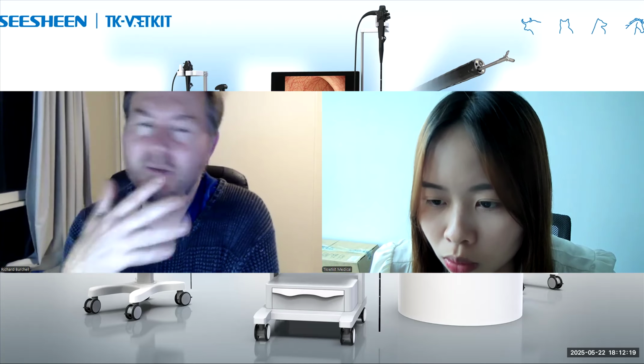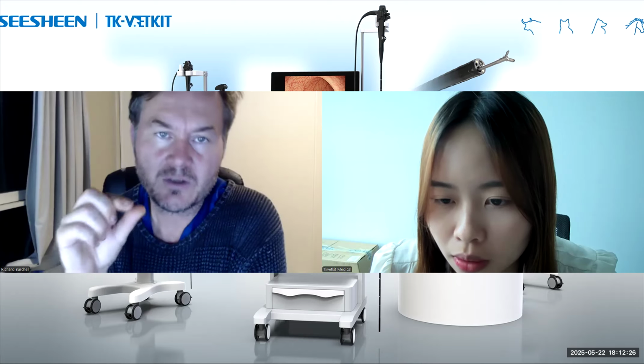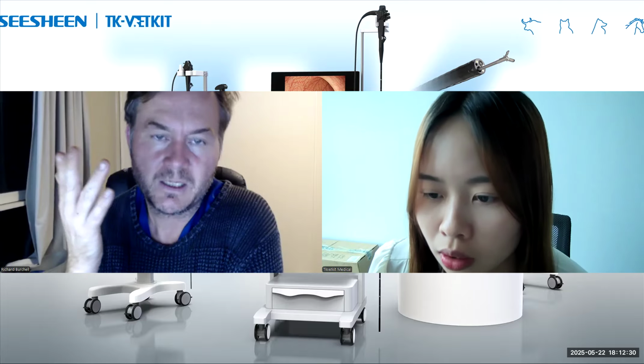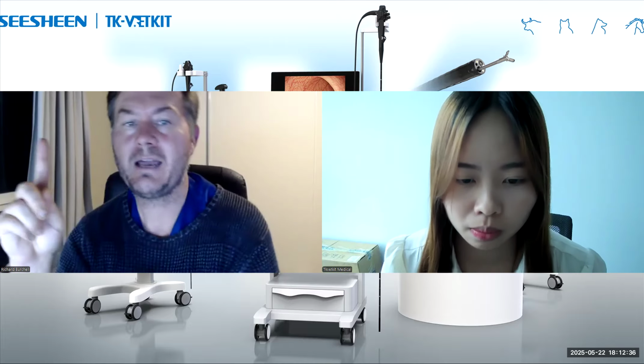It depends on what you've got already, but if you were going to buy a scope, you'd be better off learning to do rhinoscopy with a small flexible bronchoscope, which I have done in the past, because that has wider applications than a rigid scope.